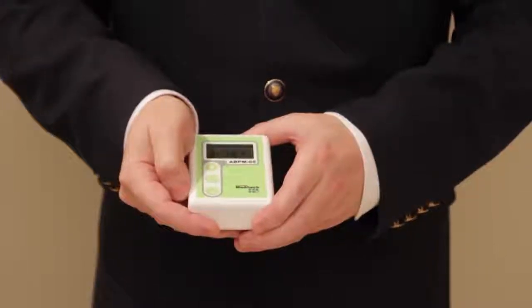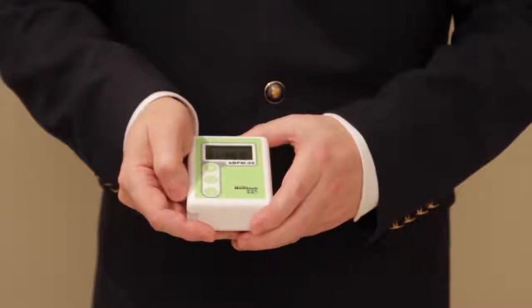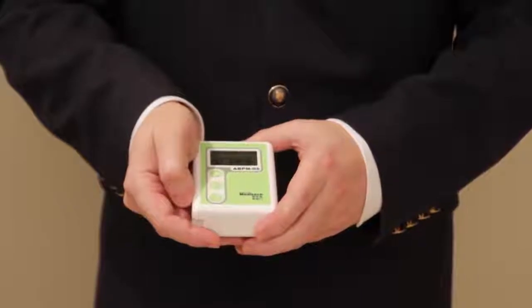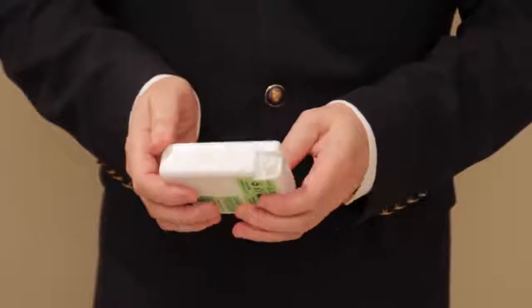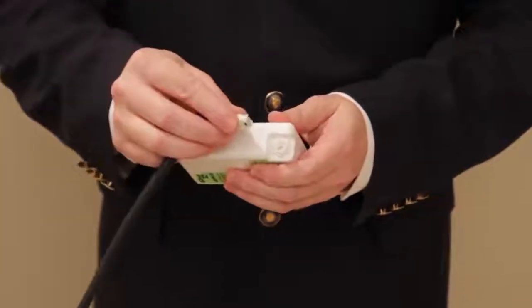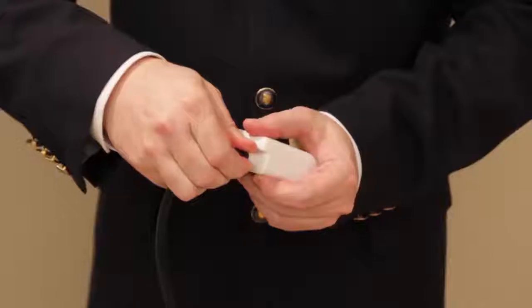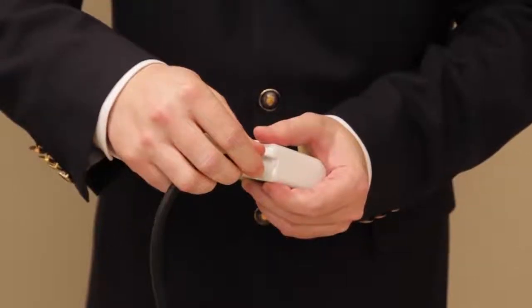But of course, this is just the theoretical operation of the device. If you really want to operate it, you have to have a cuff properly applied to the upper arm of the patient and connected to the device itself. So here's the cuff connection point. To connect the cuff, you just take the end of the tubing, plug it into the device like this, and turn clockwise until a small click is audible.